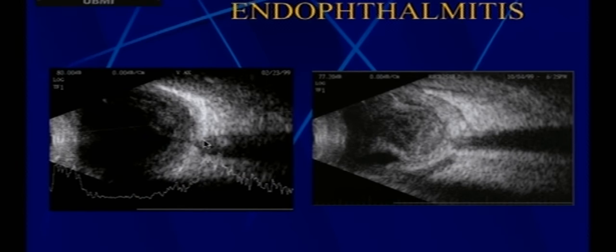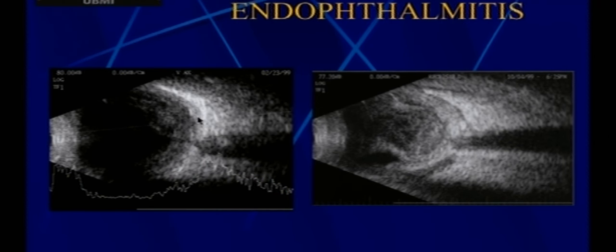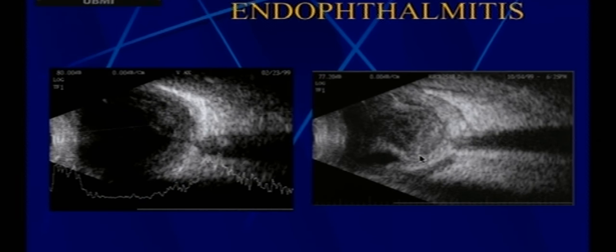The role of ultrasound in intraocular inflammation is to stage the condition and help the surgeon decide management. Vitreous echoes within the vitreous cavity alone with no chorioretinal thickening = vitritis. When chorioretinal thickening develops, it becomes endophthalmitis. When fluid extends into Tenon's space, it is panophthalmitis. Each has different clinical significance and different management implications.